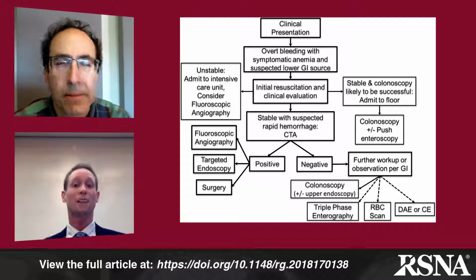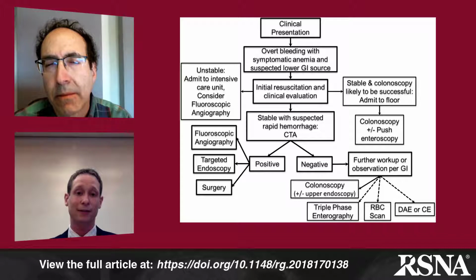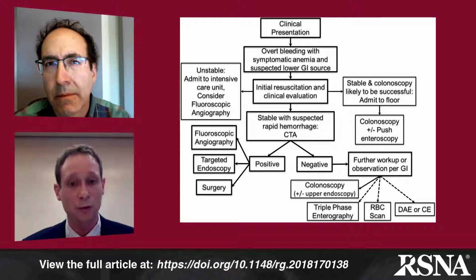Now, on the other hand, if the patient happens to have a negative CT angiogram, that's also very helpful.